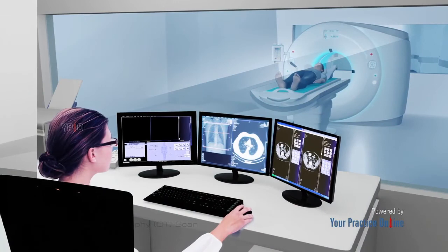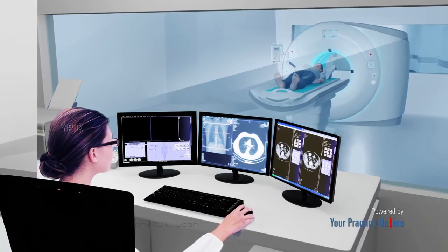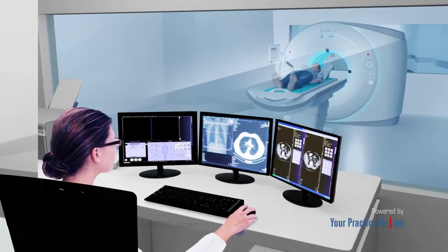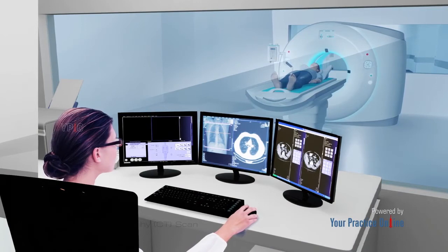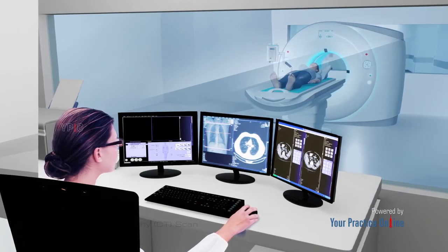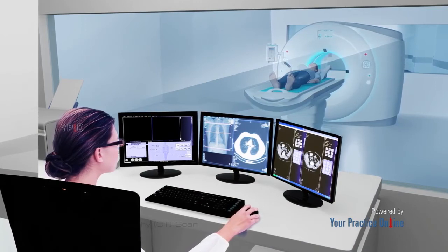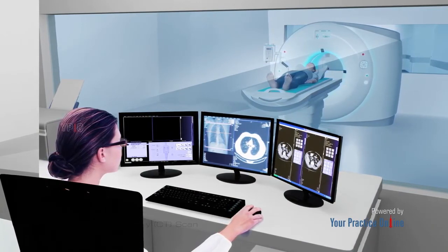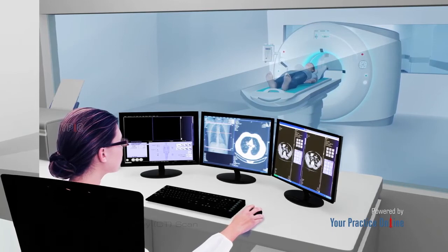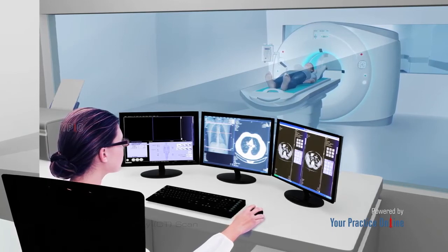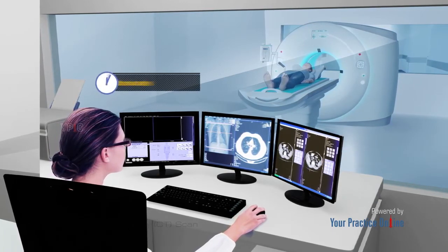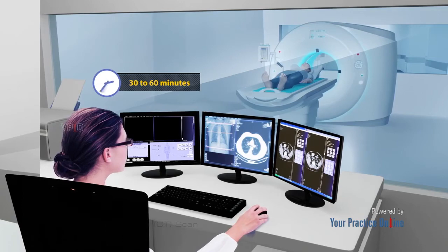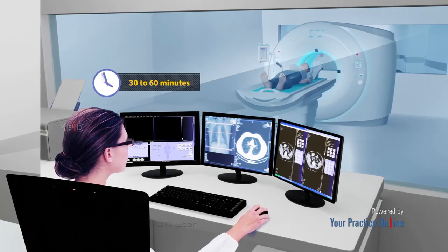You should lie still during the procedure, as this increases the clarity of the images. The CT scan technologist will watch you through a window during the procedure. You can communicate with the technologist through an intercom, and should inform the technologist if you experience any problems during the scan. The entire procedure takes about 30 to 60 minutes.